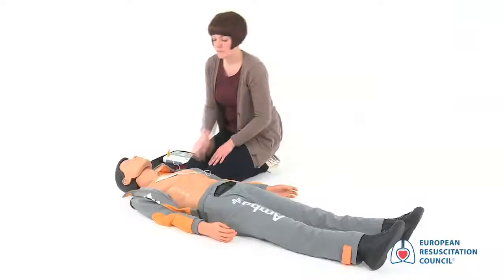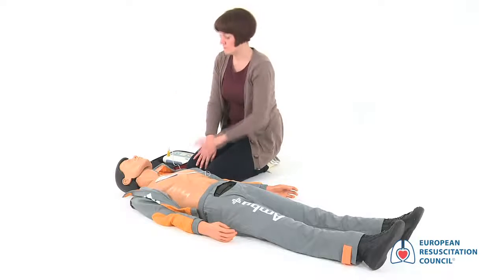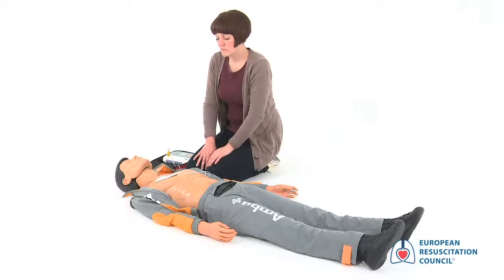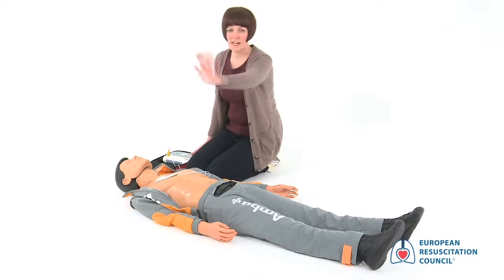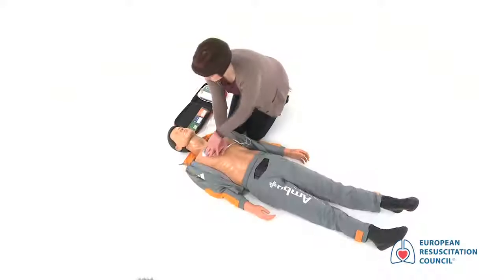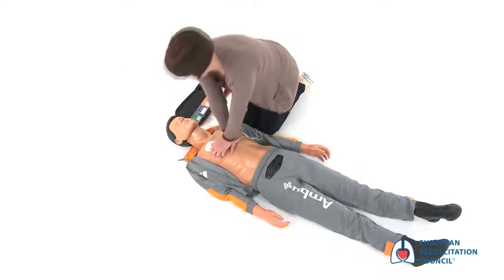Analyzing heart rhythm. Do not touch the patient. Stand clear. When prompted by the AED, look to see that everyone is clear and call "Stand clear." When prompted by the AED, press the shock button. Deliver shock now. Press the orange button now. Shock delivered. Begin CPR. Start CPR again as soon as prompted by the AED.